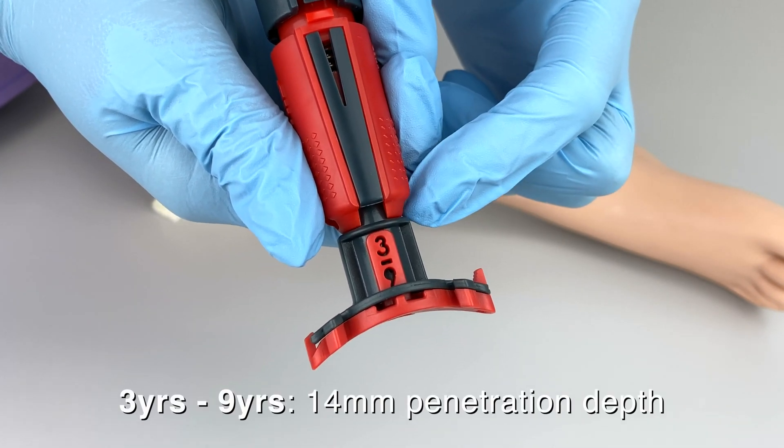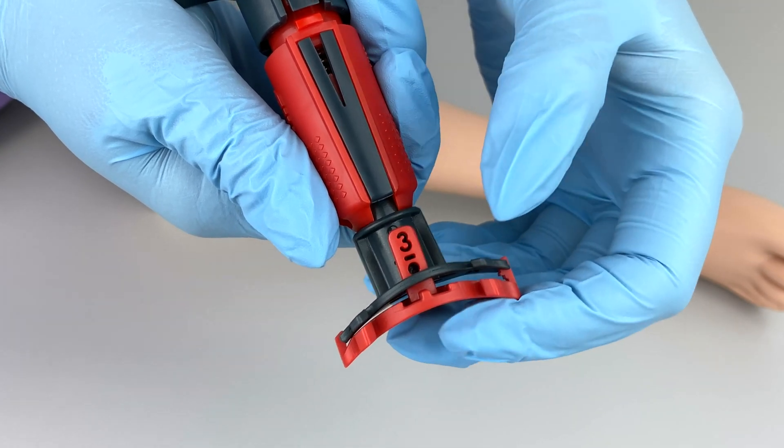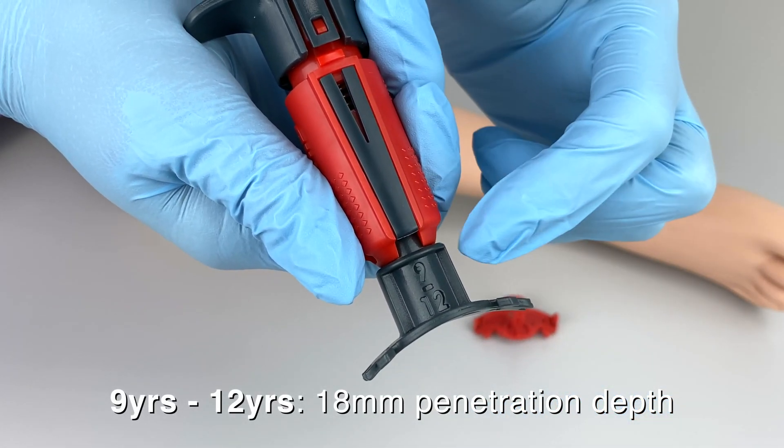3 to 9 years of age has a set penetration depth of 14 millimeters. Once you remove the red spacer, the penetration depth increases to 18 millimeters, intended for patients ages 9 to 12 years of age.